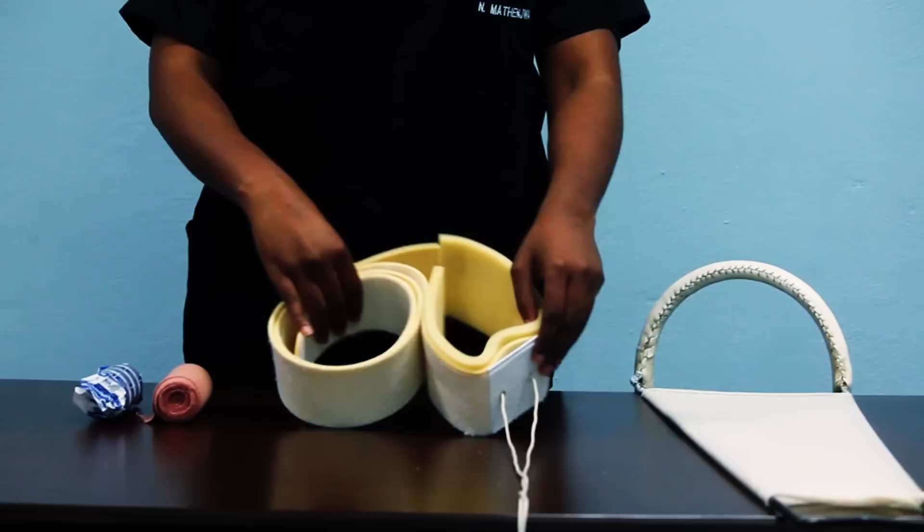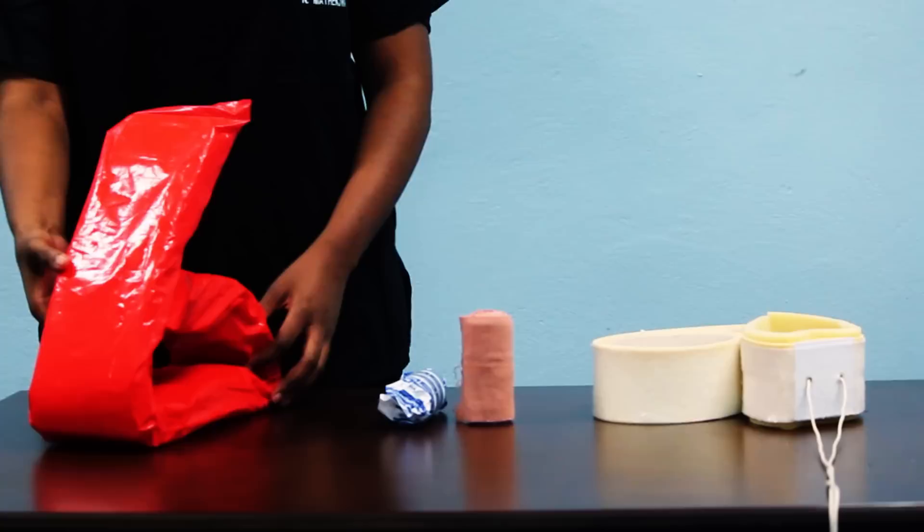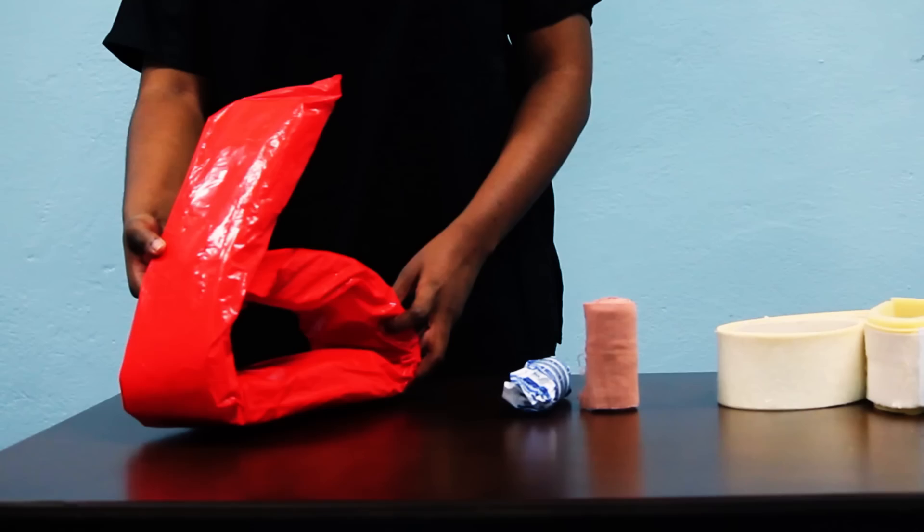We also have a skin traction device, two elastic bandages to wrap around the skin traction device, and something to elevate the leg once the application process is complete. Here we've used a crema wire splint, but you can use a pillow.